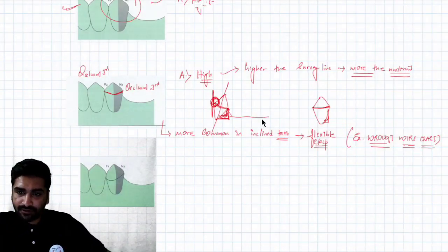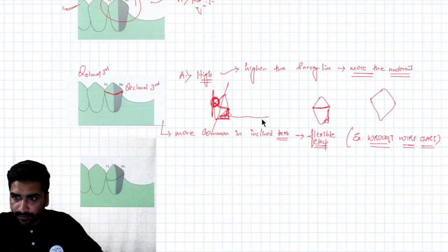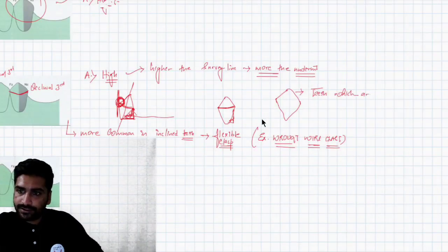Or sometimes not only in inclined teeth but also in the teeth which are bulkier on the occlusal third.